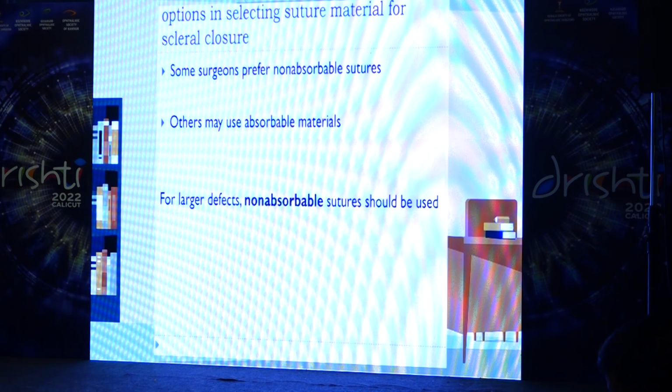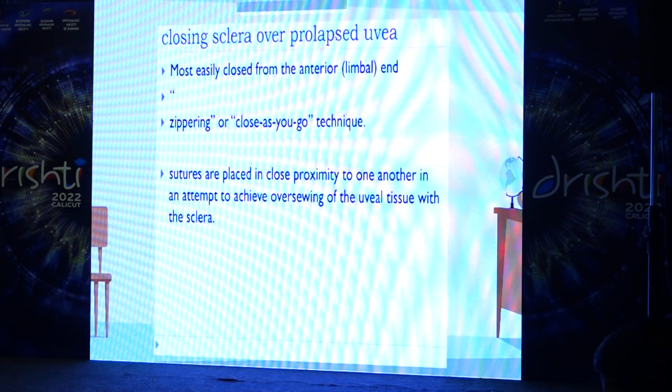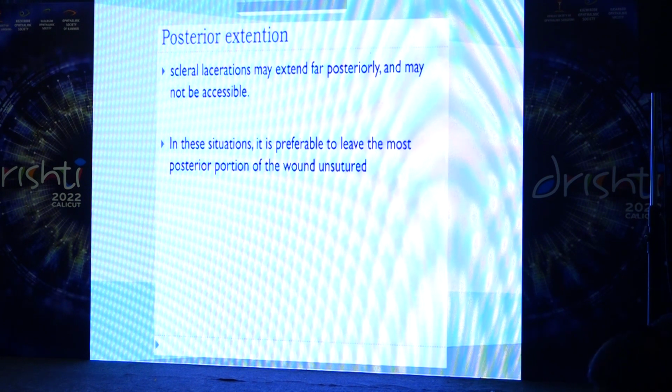So for sclera, many of us prefer to use absorbable sutures. If it is a long wound, you can use even non-absorbable sutures also. So you go through a close-as-you-go technique or zippering technique. The most posterior extension does not always have to be sutured.